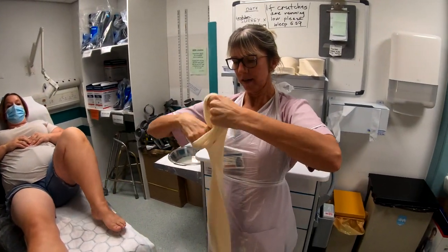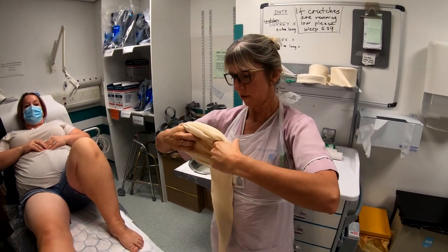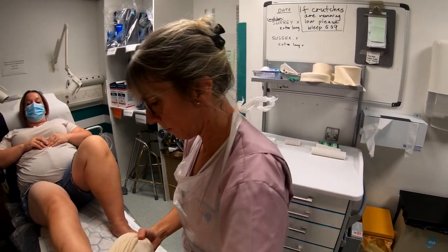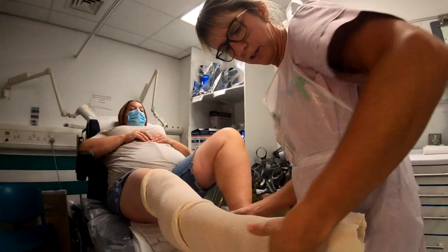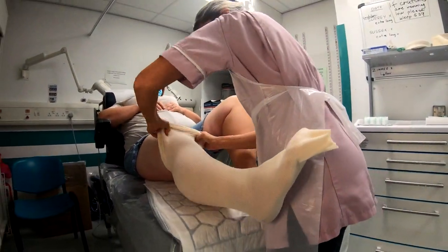You also need to note that the person who's applying the plaster is in charge, because they're cutting the plaster — they know exactly where they want to put it. So they are in charge of the plaster and they are the ones that are going to apply it. Once you've got it all ready and cut, you can then go and find two more people to help you with this application.